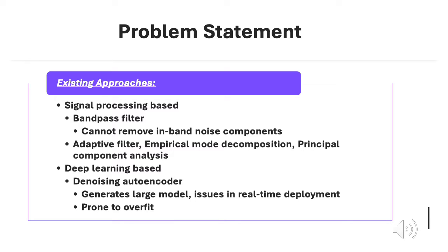Although the deep learning models often outperform the signal processing based approaches, they generate large models which have issues in real-time deployment, and also deep learning models are often prone to overfit.